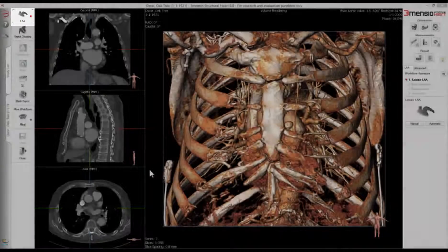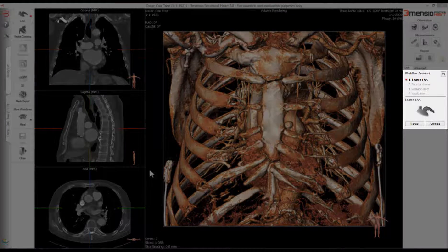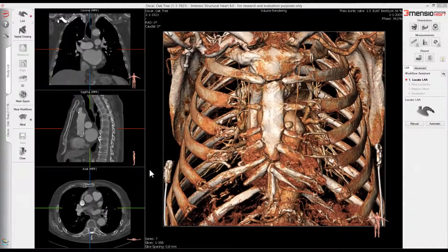On the right side, a workflow assistant is present that will guide us through the assessment. During this workflow, we will assess the following four aspects: presence of thrombus, LAA morphology, LAA measurements, and LAA orientation.